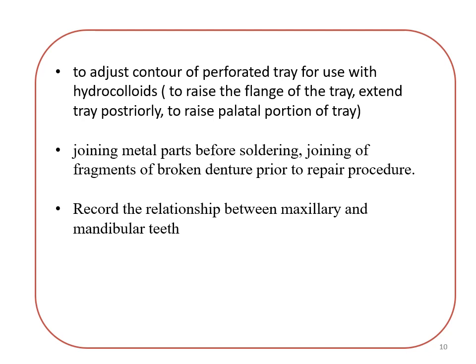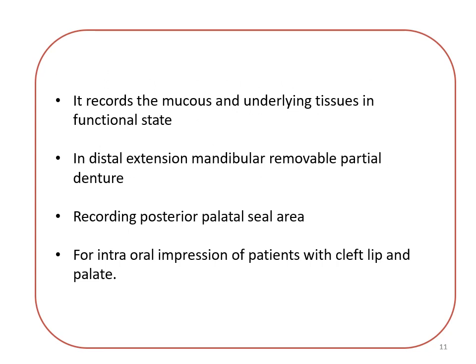Joining metal parts before soldering, joining of fragments of broken denture prior to repair procedure, record the relationship between maxillary and mandibular teeth. It records the mucosa and underlying tissues in functional state in distal extension mandibular removable partial dentures, recording the PPS area for intraoral impression of patients with cleft lip and palate.